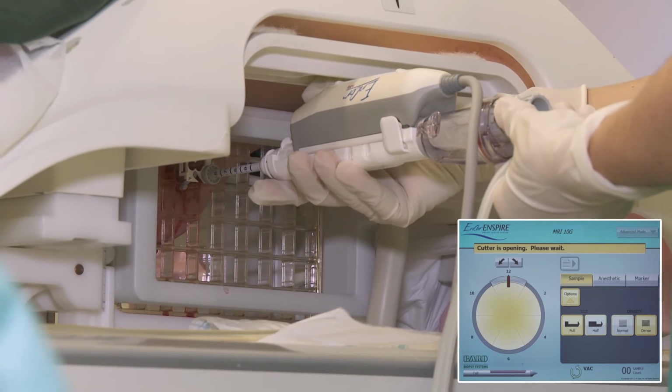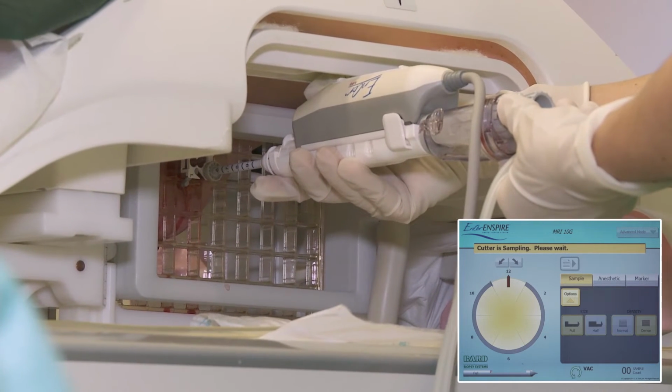Sampling is started and full pattern completed in a few seconds.